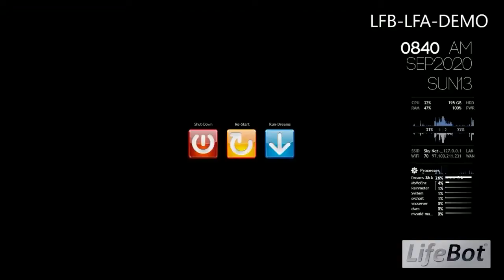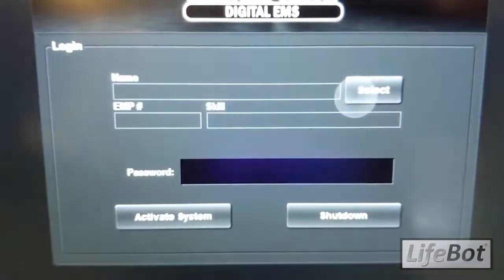The LifeBot system is currently running on battery power. We're going to launch the main interface, then we select the appropriate user profile and log in.